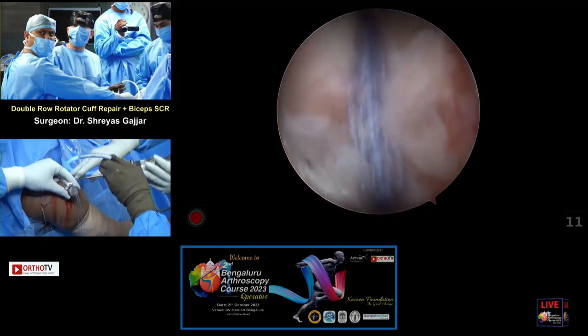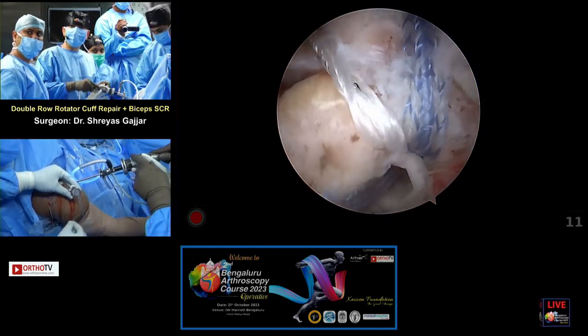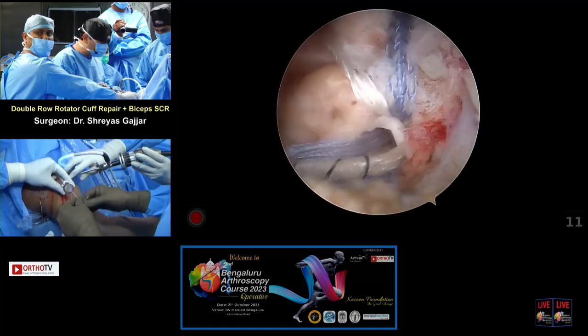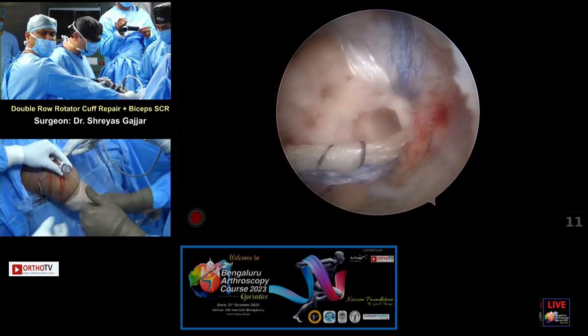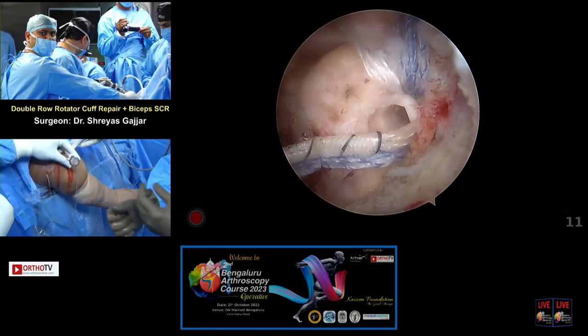So I'll just have a look here. It's fine, there are no dog ears. Hold this piece, Rohit. So I'll remove the eyelet suture. Can I have the tape cutter, please? Thank you. With the tab and the mosquito. Thank you.